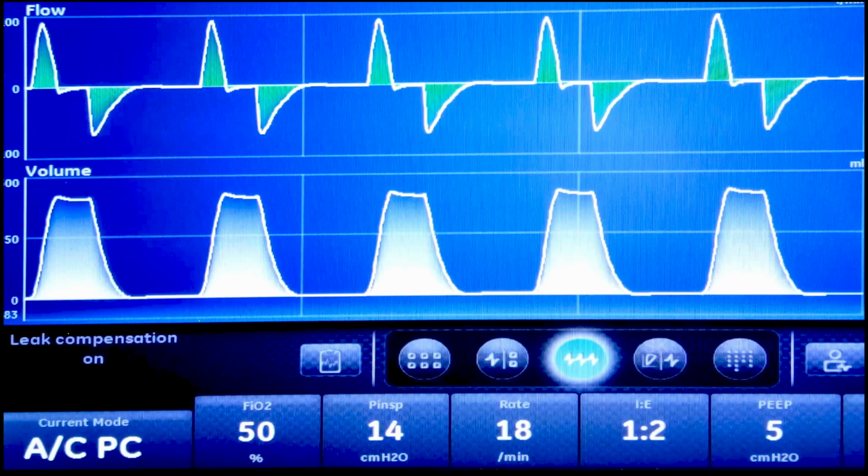Now, coming to pressure control ventilation, generally it's a decelerating flow. With some adjustments, square flow can also be obtained, but deceleration flow is often what is obtained, and that is the de novo flow pattern for pressure control ventilation. As was already mentioned, theoretically, deceleration flow is supposedly better because of better gas distribution, and this is based on in vitro data in the lab using the deceleration flow pattern and looking at gas distribution.